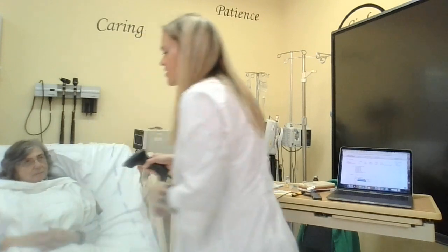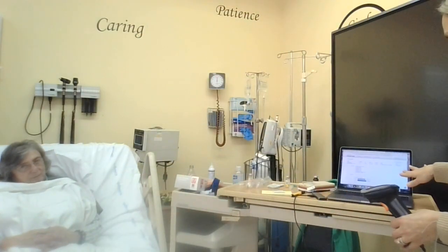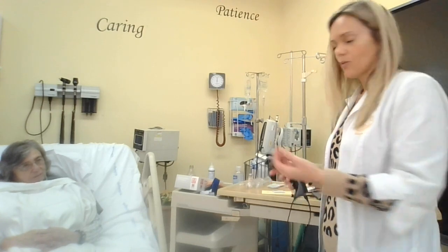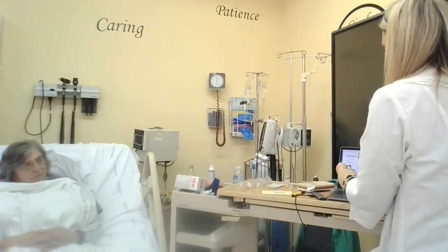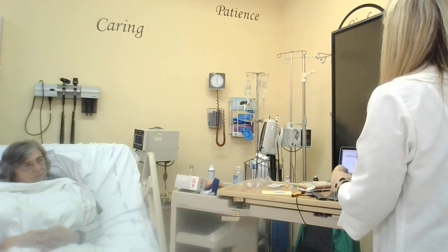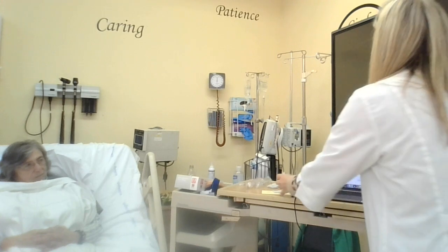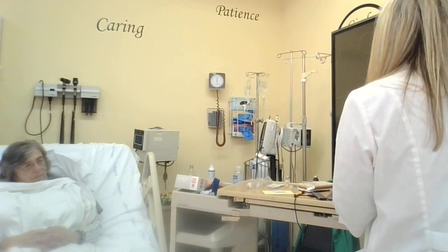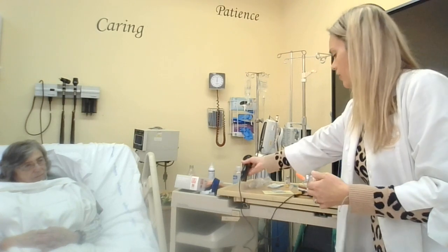And you just said Chris Jones 125XX, and that matches in my chart. So that's wonderful. So the next thing I'm going to do as the nurse is scan the medication so I can do check 3. So I've got my regular insulin, and I'm going to go ahead and scan it and hit scan. Okay, and we've got regular insulin. I've got 4 units of regular insulin for my right patient, Chris Jones. It's subcutaneous, and it's due right now at noon prior to lunch.